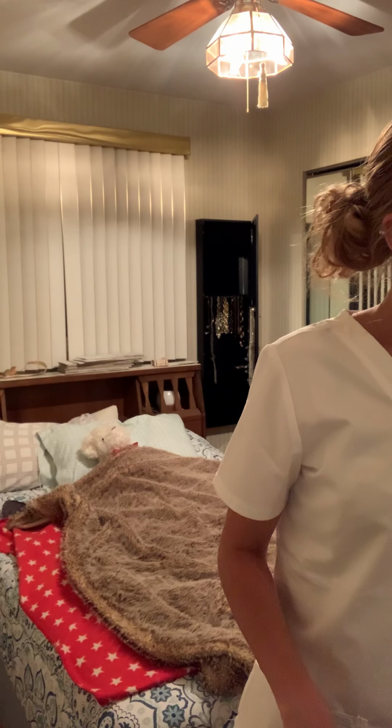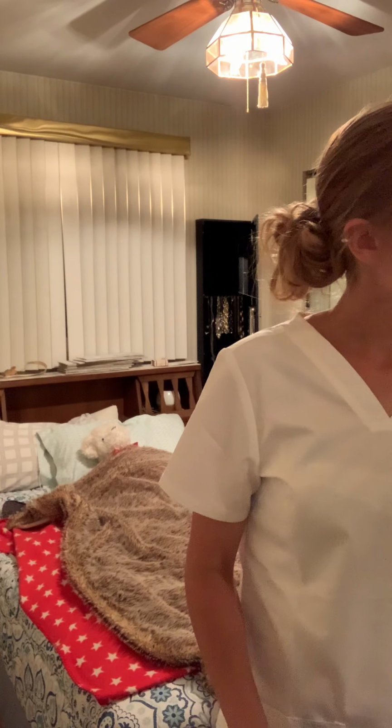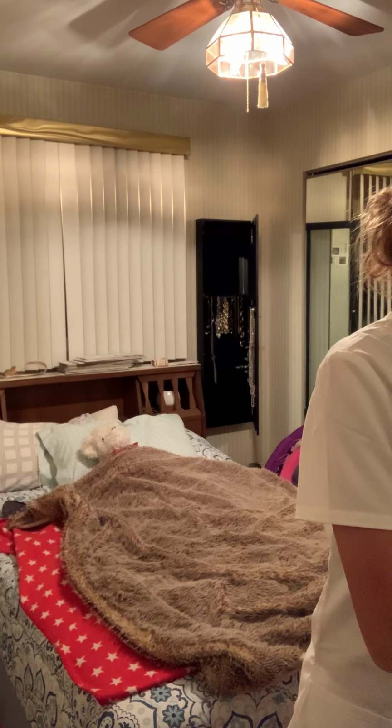And also the same thing goes for the top sheet as well. So now you are supposed to make a 2-inch toe pleat across foot to bed. Should be about 6 to 8 inches from foot of bed.